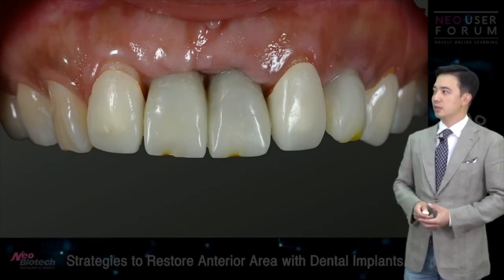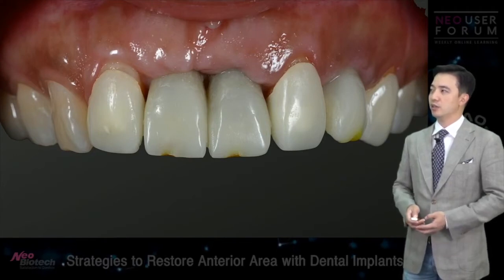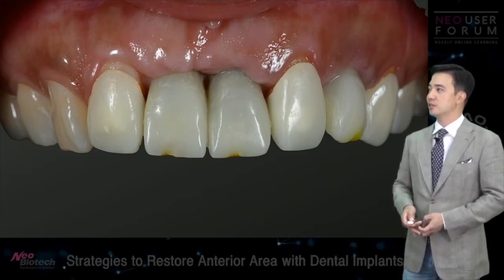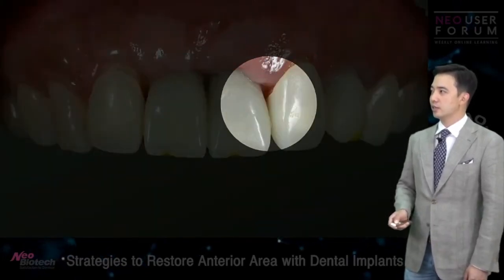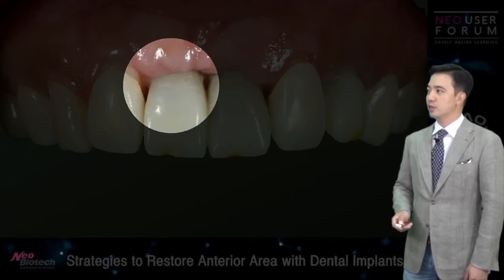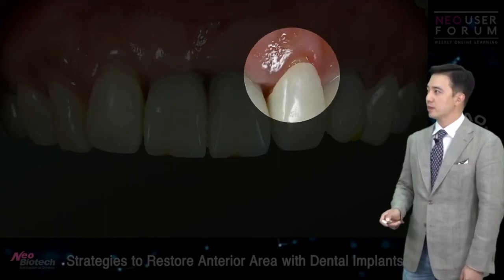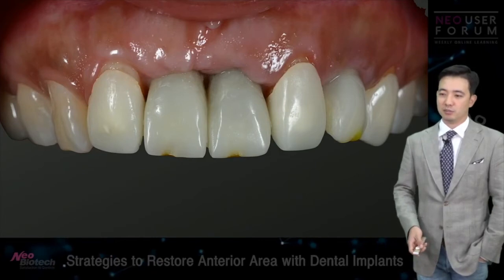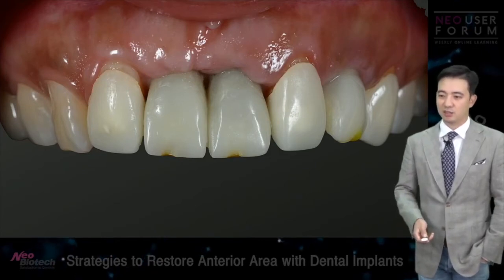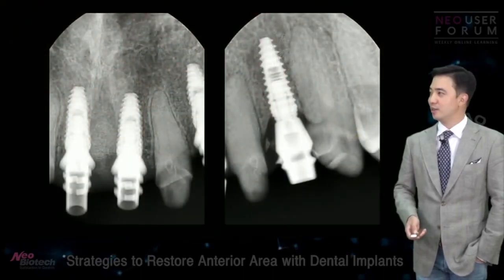Well, the patient tells me that, okay, doctor, we don't see the metal part anymore because those two were covered by resin here. But you know, there's still we're lacking papilla, and then we're having even more recession on the lateral incisors. And the patient keeps telling me that, oh, doctor, my teeth are getting longer, and I don't like that. I'm like, okay, so I could see this coming.